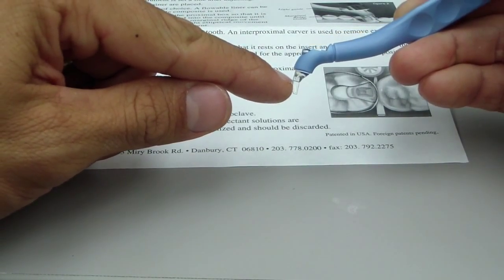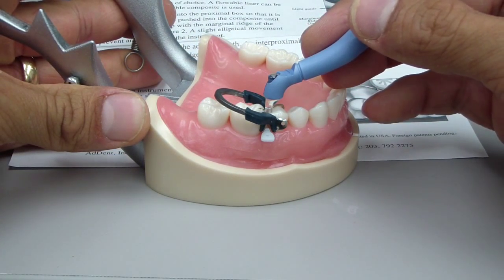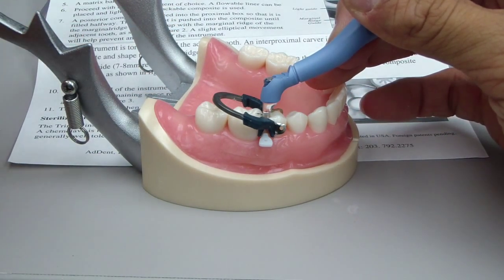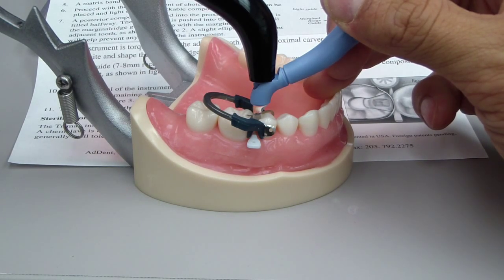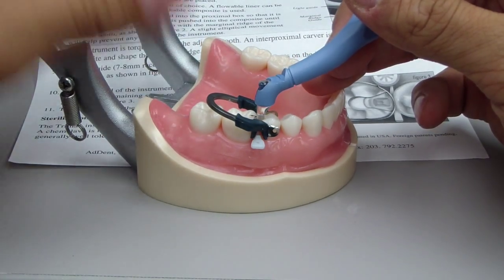I think they're talking about that right there. So what you do is you place it into the proximal box, place pressure against the adjacent tooth, and then go ahead and cure through using your curing light through the transmissible plastic clear curing tip.